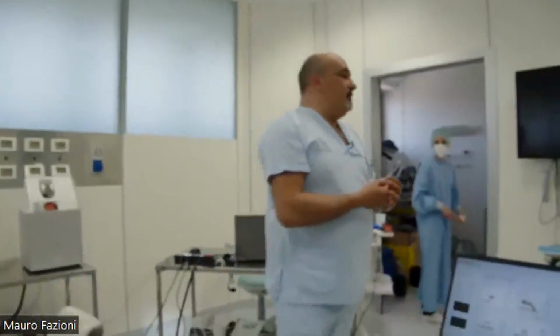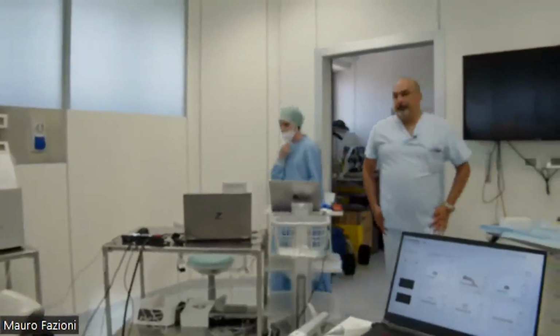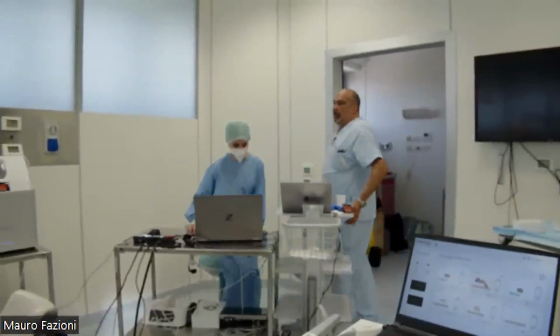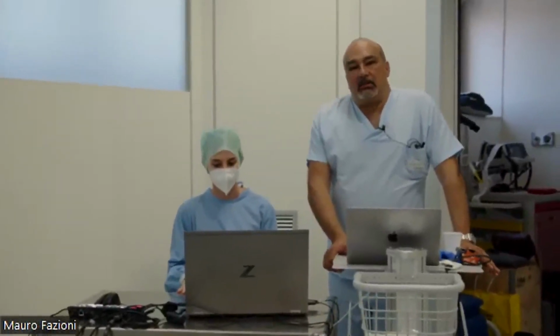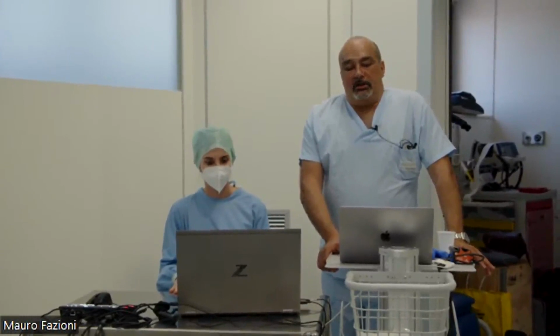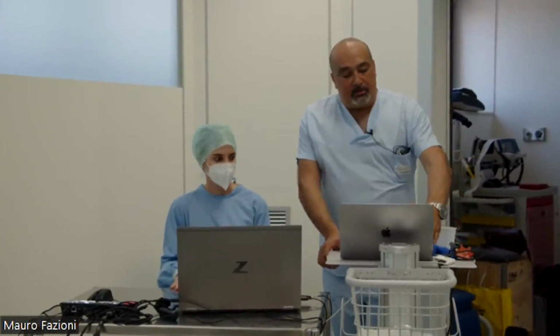This is the complete one-day approach. So, intraoral scanning, design, software interaction, collecting the true color, sharing the patient's movements.